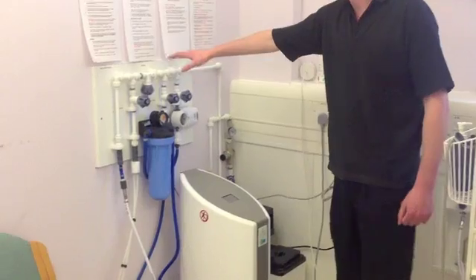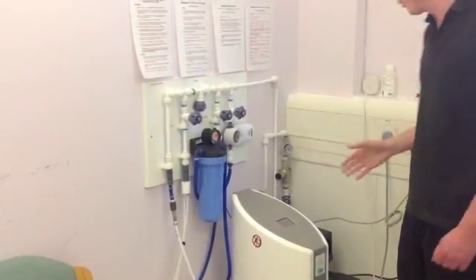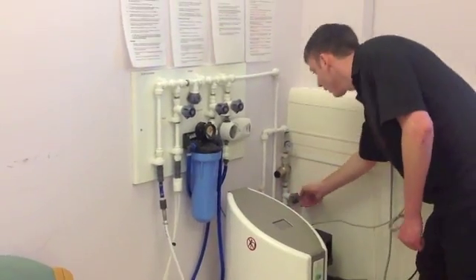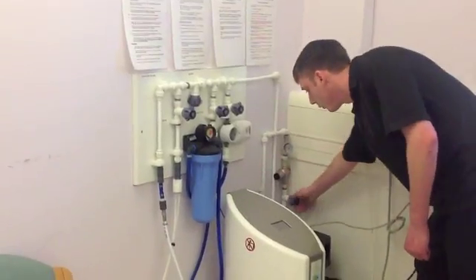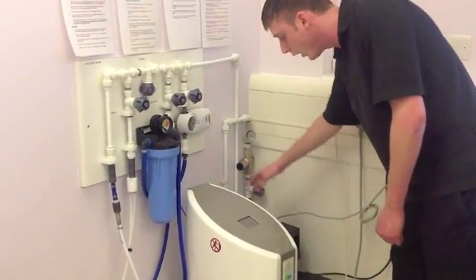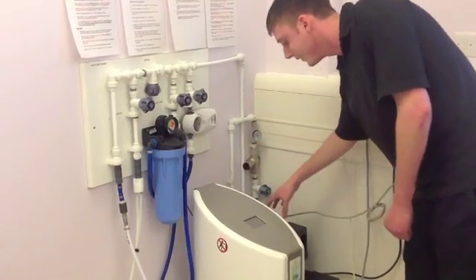Now the valve board assembly itself: first of all you have your water in coming through this fluid pathway. This should always be off when you are not using it, just in case you do have any leaks. It passes along this fluid pathway into the softener.